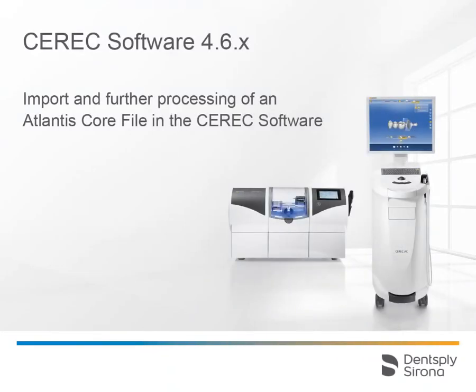Welcome to this video tutorial on the topic of import and further processing of an Atlantis core file in the CEREC software. This video will take us through all relevant phases and steps, from the administration phase to the manufacture phase.